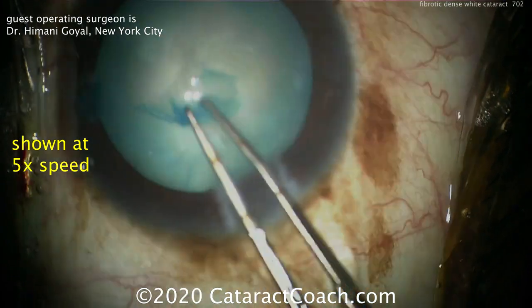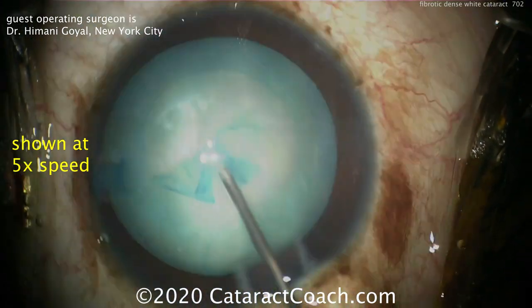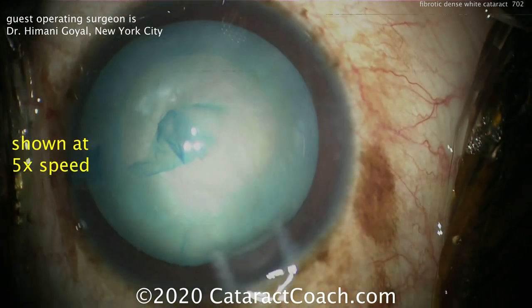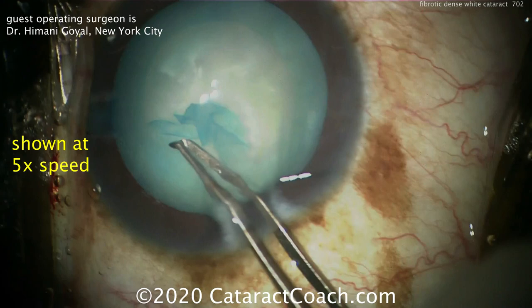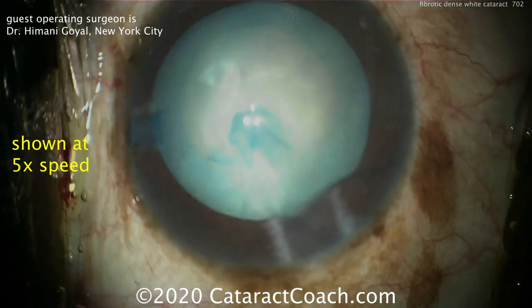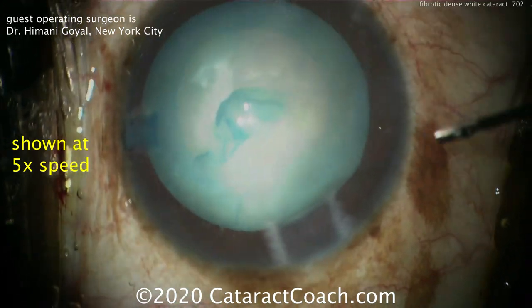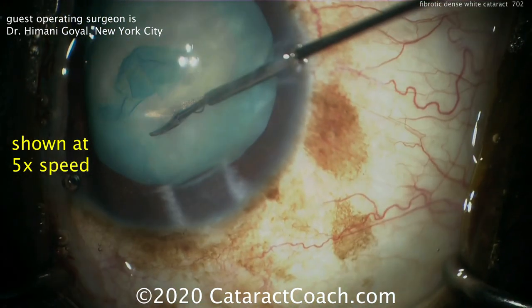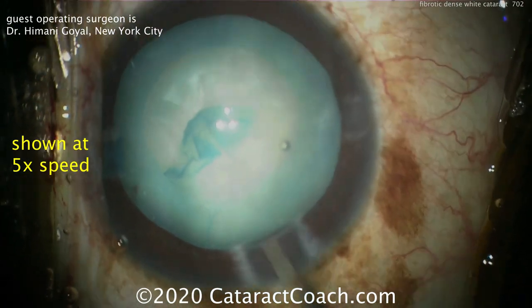Completing the capsulorrhexis, which looks just about perfect, and bringing it over and finishing it up — and again it gets stuck. So more viscoelastic to the rescue, grabbing it with the forceps and trying to complete it. The option is to go back to the retinal scissors, so a little more viscoelastic, then making another entry site and coming in with the scissors to cut it and complete the rexis.